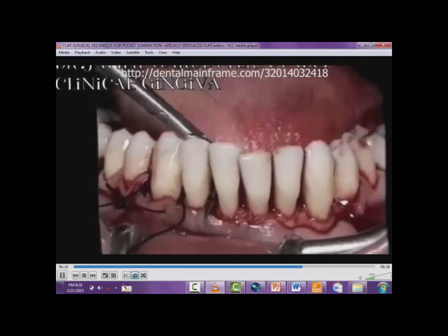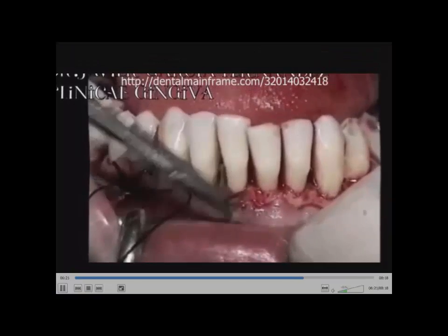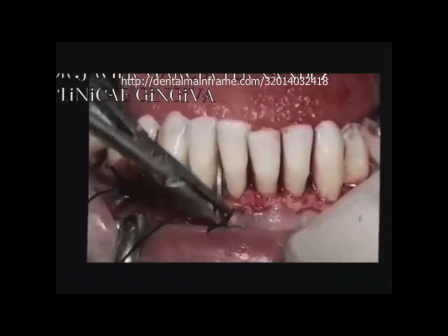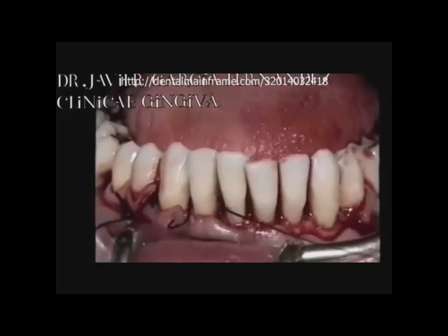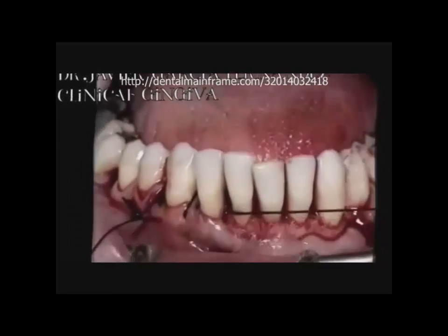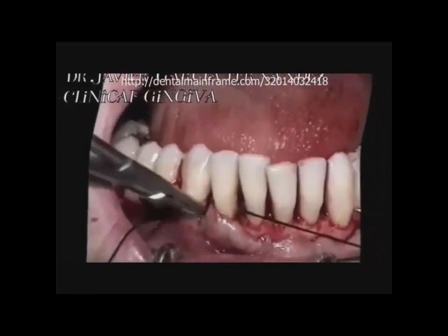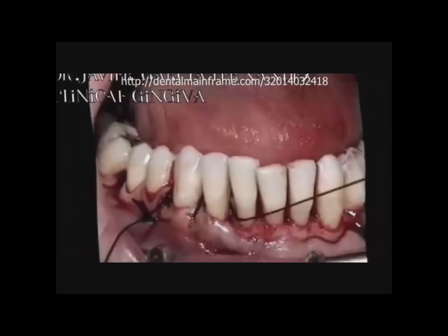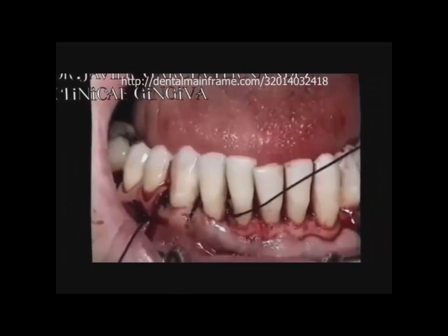The Apically Repositioned Flap is done. The key concept is that you don't return the flap to its normal position — instead, you reposition it apically from the tooth structure. This will allow clear access for the patient to clean.